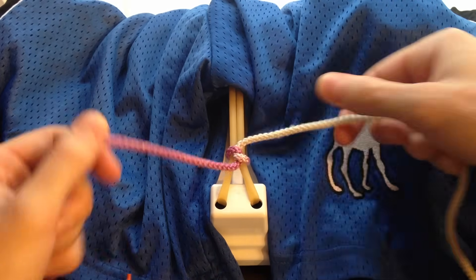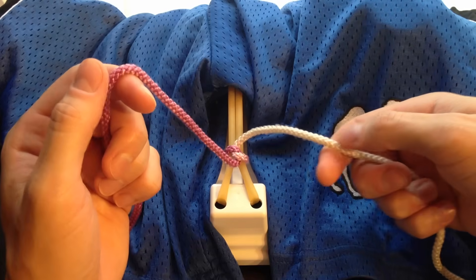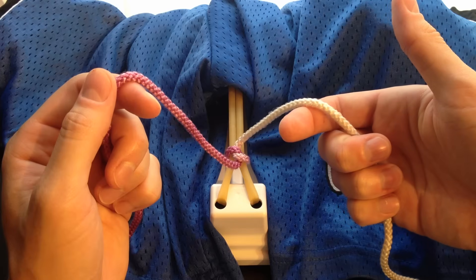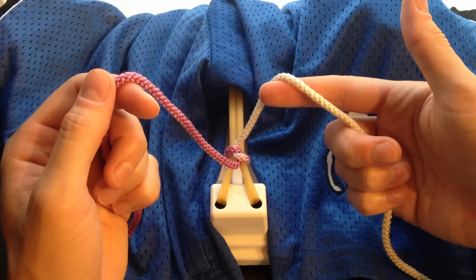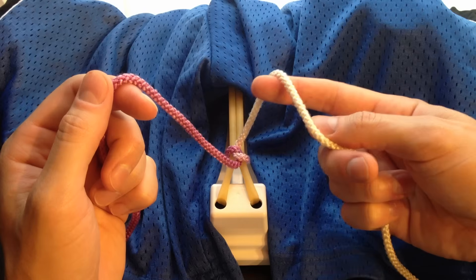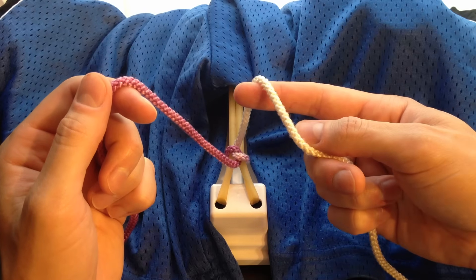Pull it tight — first knot's done. The second one starts the same way. Essentially, securing the string with your lower three fingers, you're going to extend your pointer finger. And with your thumb to help position it, you can see that we form the shape of a claw. I like to call this move the claw.